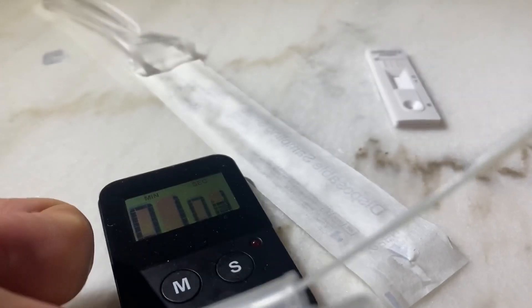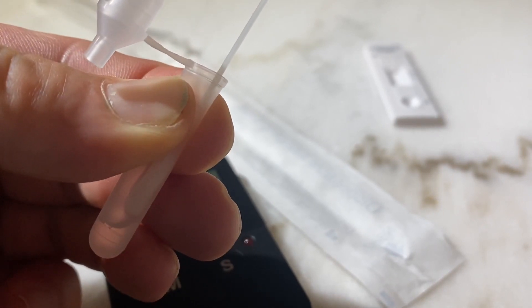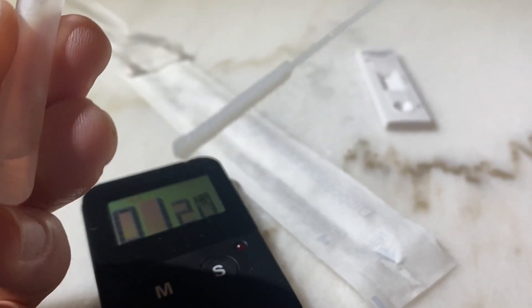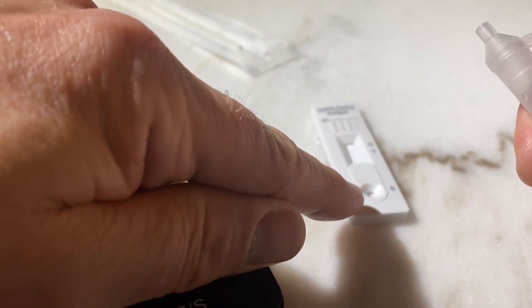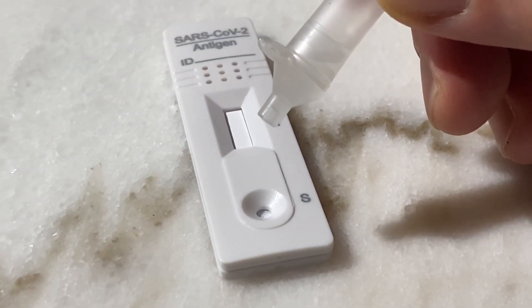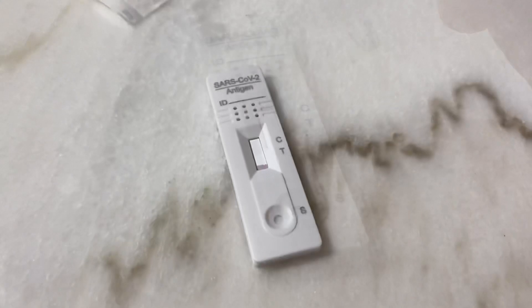Now grab the container — it's a little soft so you can pinch it with your fingers — and pull out the cotton swab so that most of the solution that was sitting inside the cotton stays inside your container. Close the container; it has a little nozzle so you can target the sensor. Now drop three droplets onto the little hole on the test card: one, two, and three. Now we should have the results in 15 to 20 minutes.